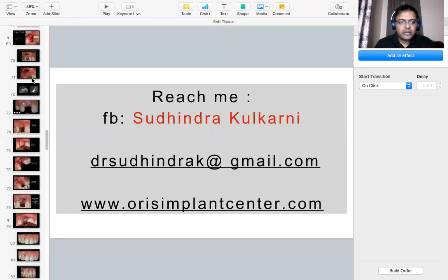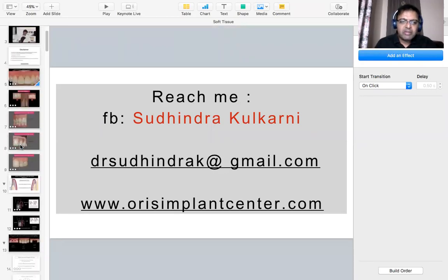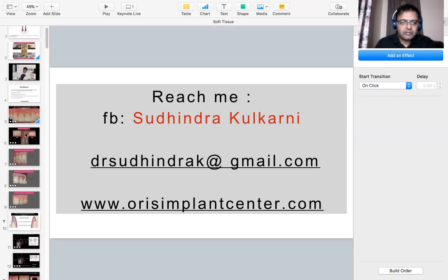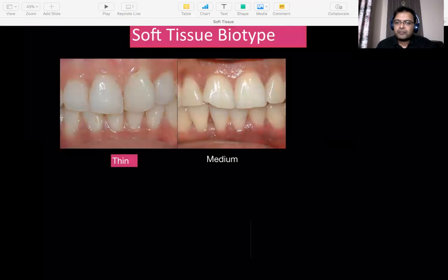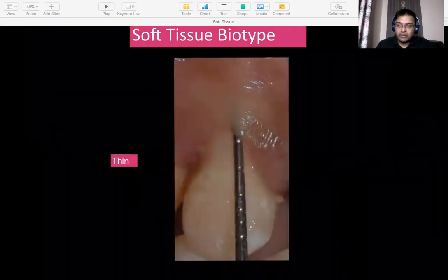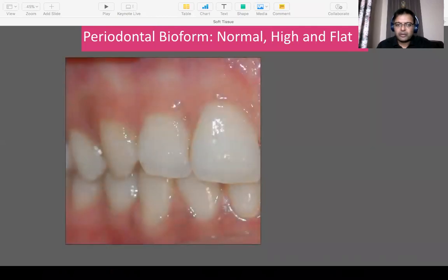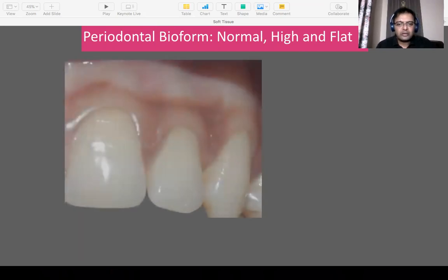I would look at going back to these things that I want you all to remember. The must-know things for every student would be the various types of biotypes here that you see. Also, how do you evaluate the biotype? It's not just for perio reasons and also for implant reasons and aesthetics. The next thing I want you all to know is what's a bioform, and that would determine a lot about your surgical decision making.